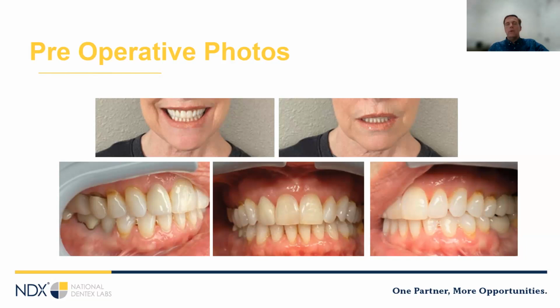So we need to see a relaxed lip image to see the maxillary incisal edge position, which is basically where all tooth position originates. A normal smile to see the buccal corridor, incisal edge, and midline inclination, and the position of the occlusal plane. And then we need a grin, Duchenne, high smile, whatever you want to call it, to evaluate gingival display. We should also have smiling and relaxed profile views to look at our lip support. Relaxed views are very helpful for clinical diagnosis, but not as relevant for your laboratory in terms of prosthetics.